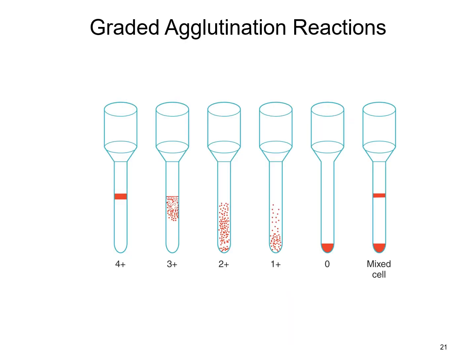Now, in immunohematology, there is a gel matrix that is actually used. So what we have here in the lower part of this sample well is the actual gel beads. They're a clear, hazy looking bead when they're all in there. And these beads are just lined up, stacked in the bottom of that tube.